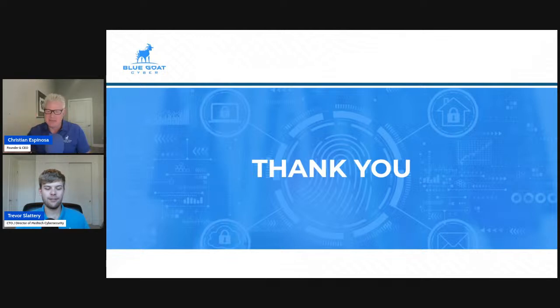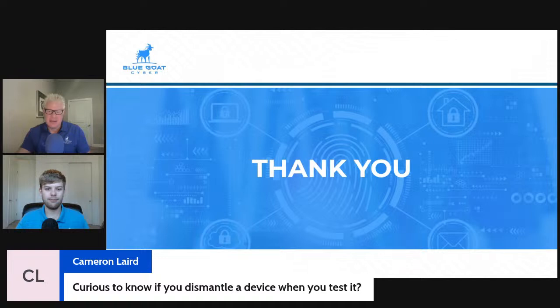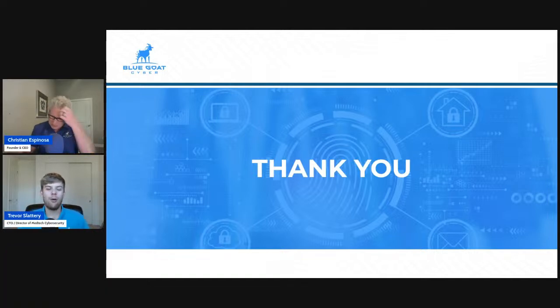It looks like we have a question here from Cameron also. Curious to know if you dismantle a device when you test it. That's a good question. It depends on how easy it is to dismantle the device, really. When I was talking about the hardware testing, we're looking at whether or not it's evident if you dismantle the device.